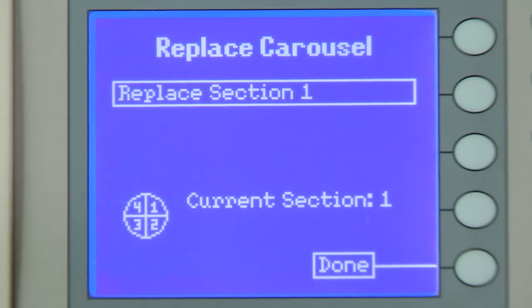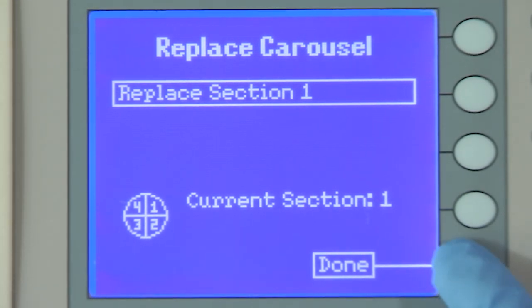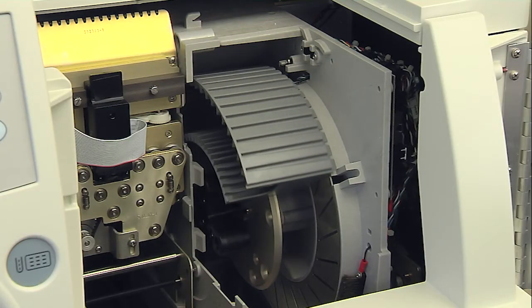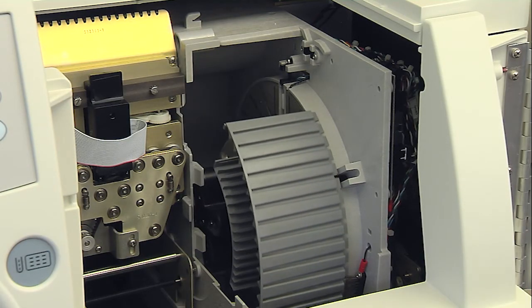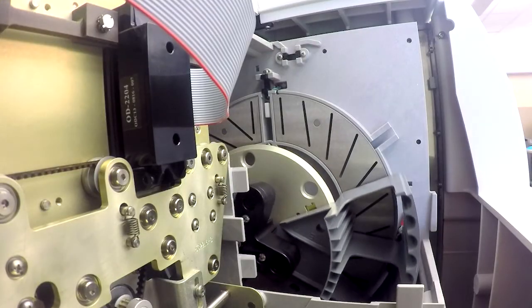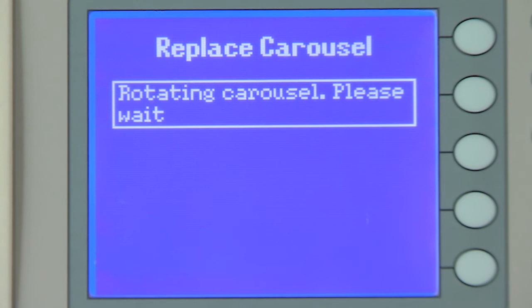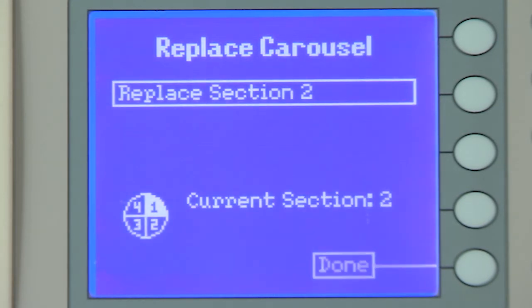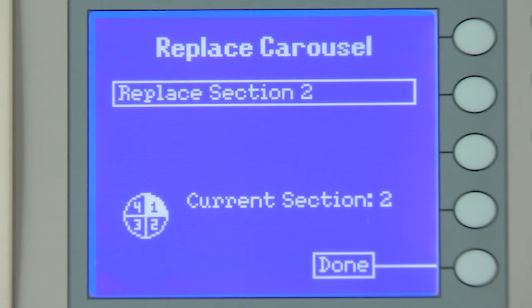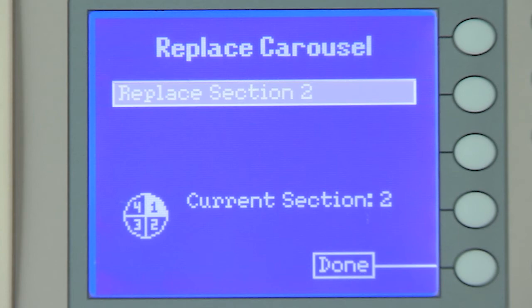Press the corresponding function key to the right of Done. The carousel starts to turn as the instrument verifies the section replacement and positions the carousel for the next section. The user interface briefly displays the message Rotating the Carousel, Please Wait, and the carousel icon indicates the section replacement. Once the carousel is in the proper position, the user interface displays Replace Section 2.